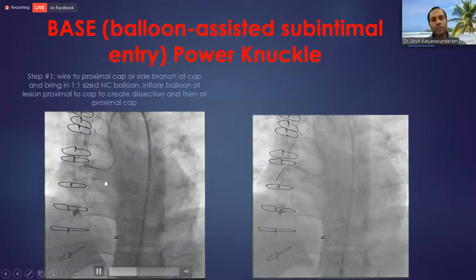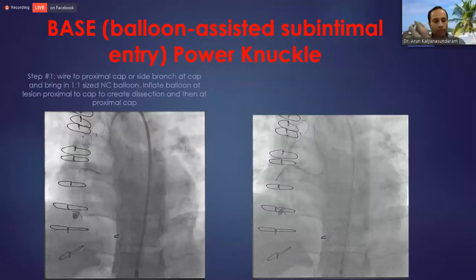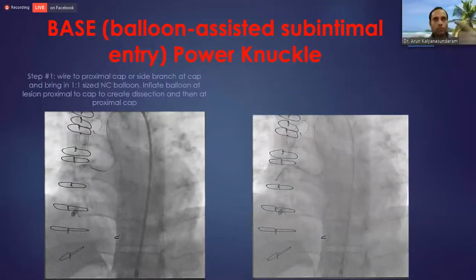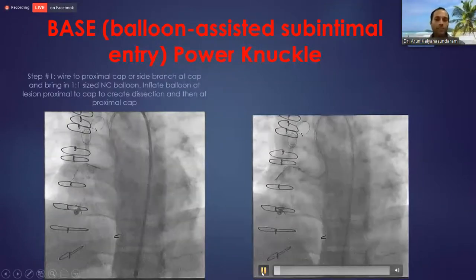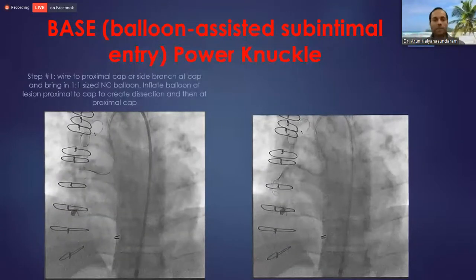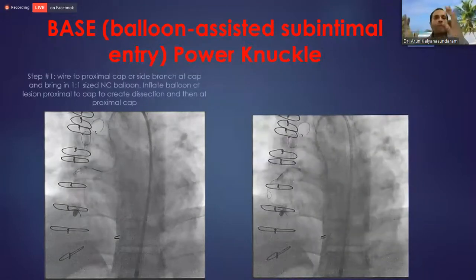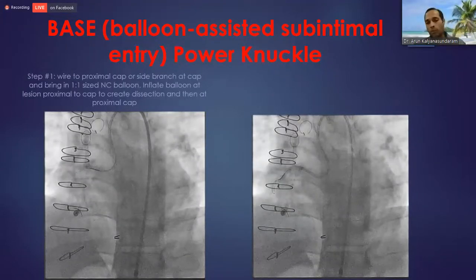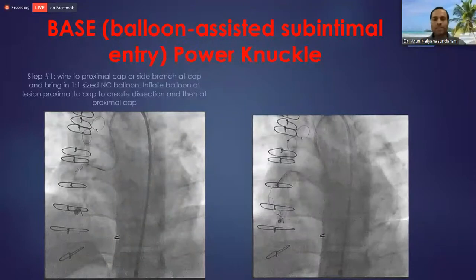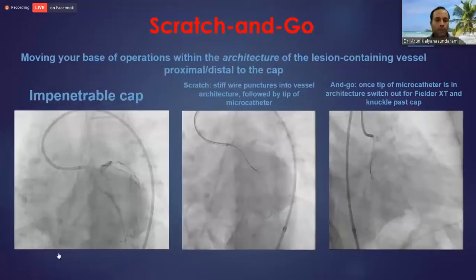BASE essentially is nothing but balloon-assisted subintimal entry, where what you're doing is actively dissecting the vessel proximally. So size it one-to-one, inflate the balloon, and balloon angioplasty really works on creating dissections. Have a microcatheter wedged to the side, and then use typically an XT or a Pilot 200 for what we use. You've now gone into the subintimal space. You've jailed the microcatheter with the one-to-one balloon, which has also created the dissection. Push really hard, the wire forms a knuckle, and you're in the vessel architecture. So that's balloon-assisted subintimal entry.